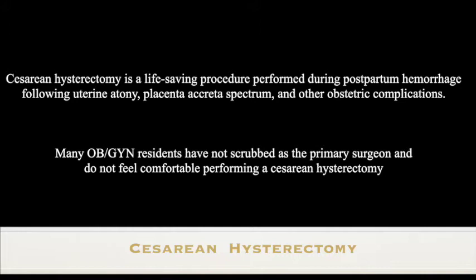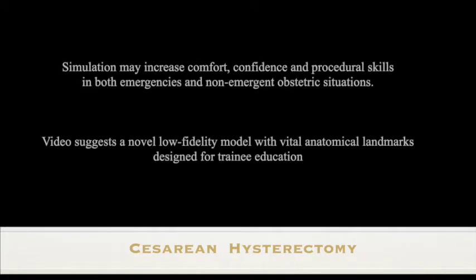and time-sensitive. Despite its growing prevalence, many OB/GYN residents have never scrubbed as primary surgeon during a cesarean hysterectomy, and many may not feel comfortable performing a cesarean hysterectomy post-residency. As simulation has been proven to increase the comfort, confidence, and procedural skills in both emergent and non-emergent obstetric situations, we elected to design a low-fidelity model with appropriate anatomical landmarks that can be used for simulation of cesarean hysterectomy and aimed at trainee education.